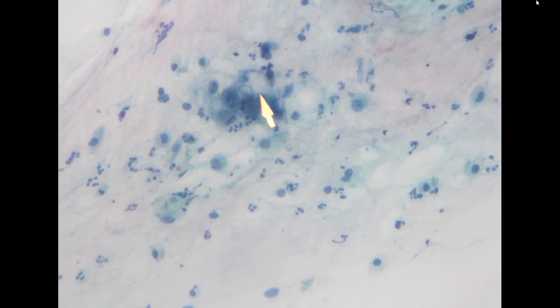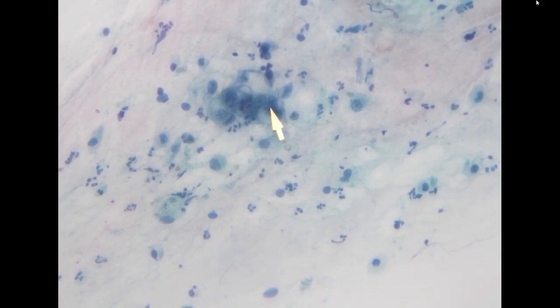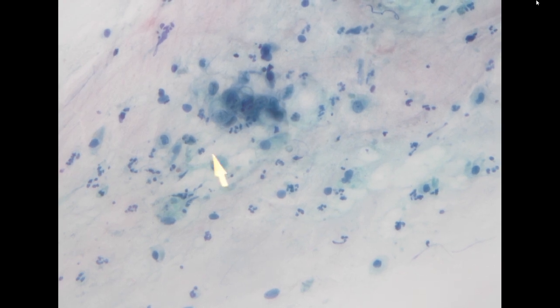So in this tight cluster, this is a cluster of degenerated cells with some variation in nuclear size, and it is very tight, which suggests it's more like a glandular lesion instead of endometrial stroma, which is usually more dispersed and single cell. So it is likely an endometrial gland with atypical features.